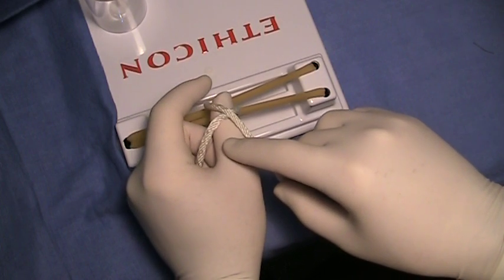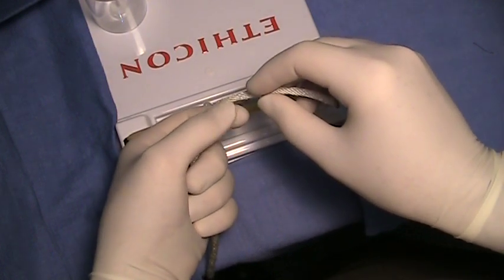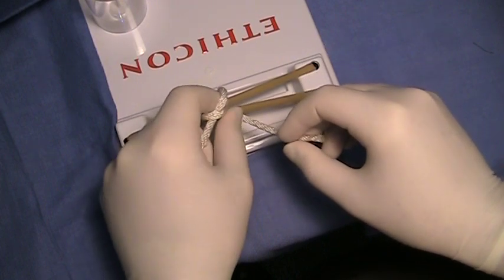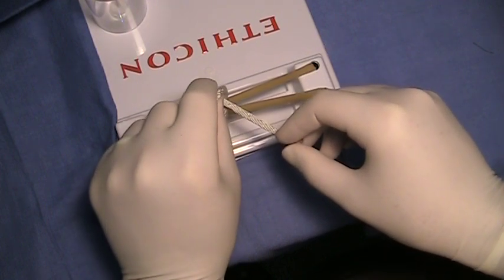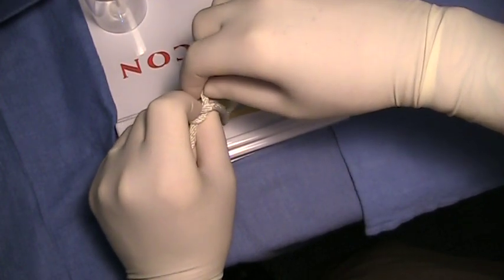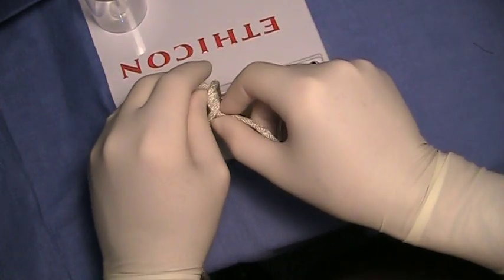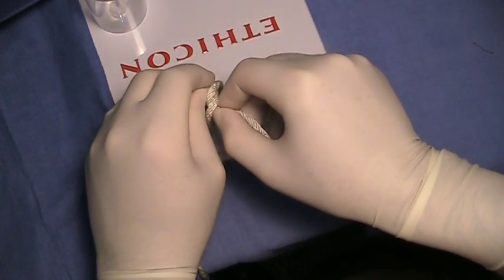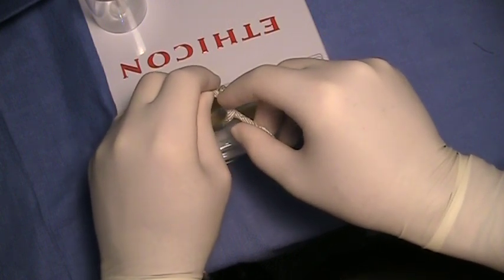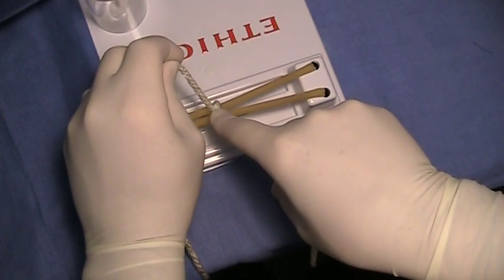You'll then pinch your thumb and index finger together. Rotate your wrist or your pinch fingers towards you. Release, pinch the short end, rotate away from you so the short end goes through the loop away from you. Re-grab with your right hand — and this is an important step. You will cross your hands so that you pull the short end towards you for the first throw, using the index finger of your right hand to maintain a tight, secure knot all the way down.